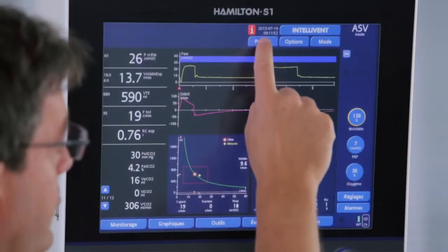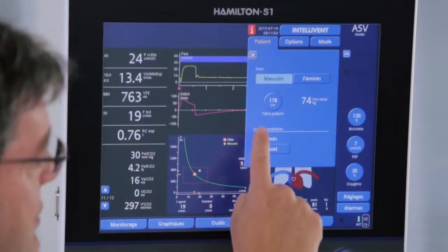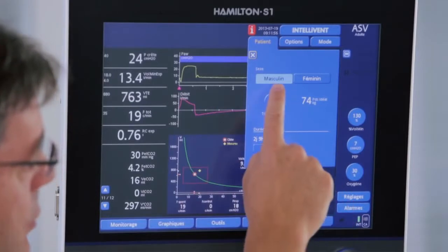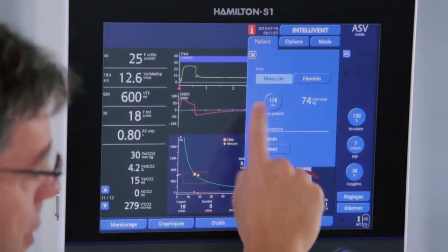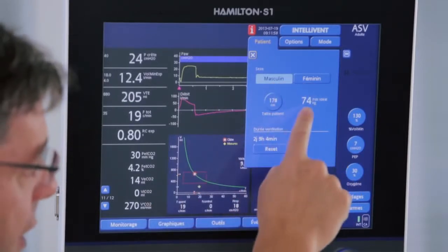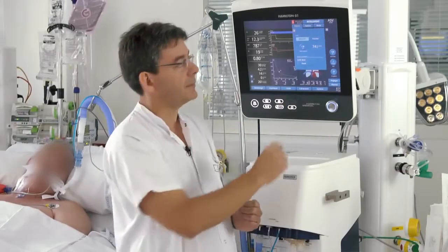The first step is to set the predicted body weight. We set the gender and the height of the patient and the ventilator will display the predicted body weight.